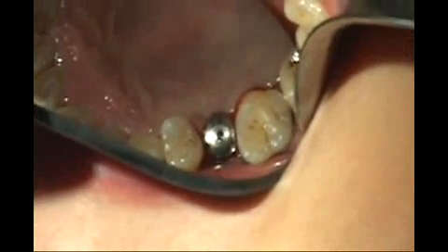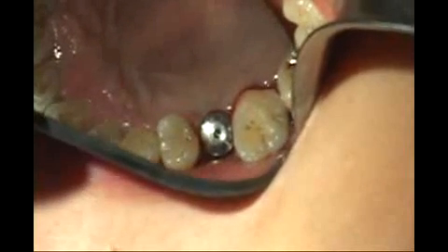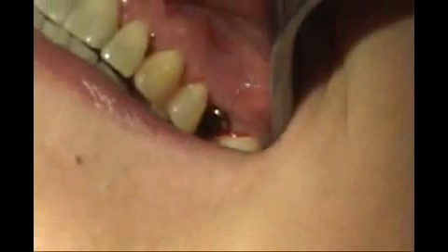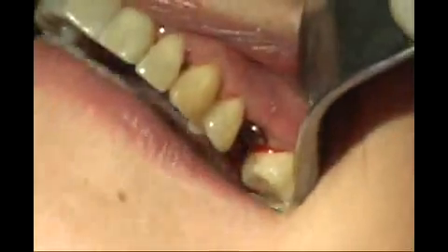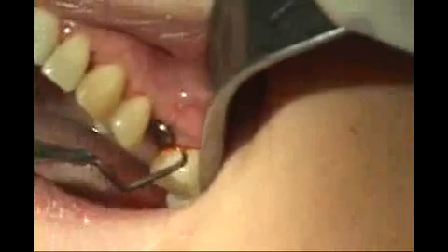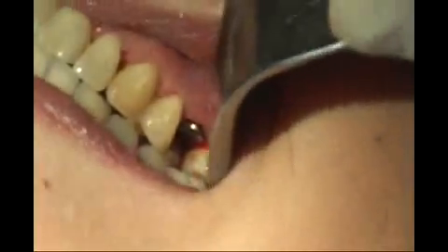Okay. So notice the healing abutment is just directly in the center. And then the buccal shot. Go ahead and close down, bite down. So you can see how the emergence profile is going to turn pretty much where the bicuspid is and where the molar is, just as such. Okay? Alright.